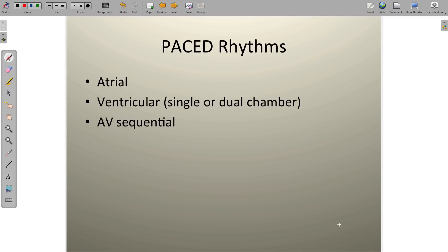Welcome everybody. Let's talk a little bit about the paced rhythms. The paced rhythms are unique in that we take a pacemaker device, implant it into the patient, run some wires into the ventricle or the atria, and then tell that device to electrically stimulate the muscle cells to cause depolarization of muscle tissue and subsequently contraction.